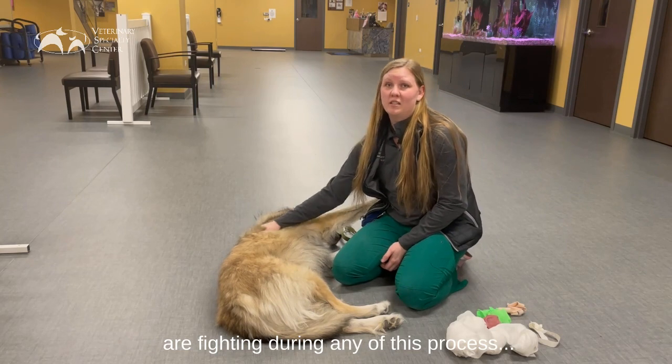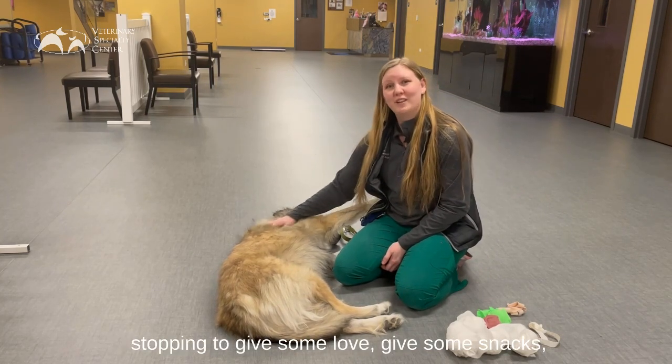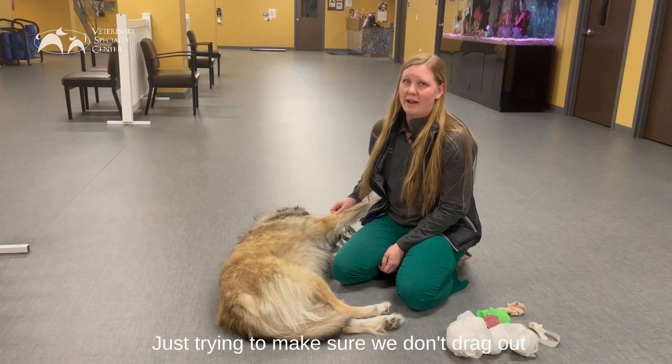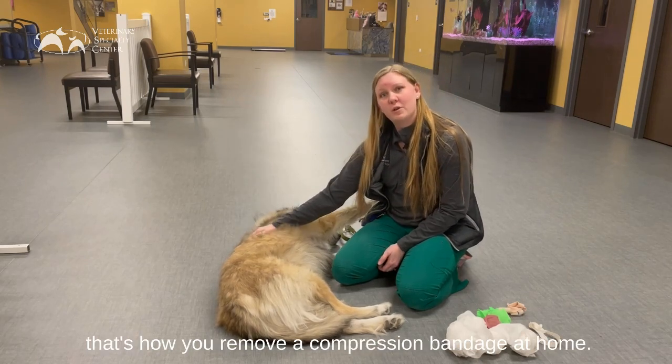If they are fighting or uncomfortable during any of this process, stop to give some love, give some snacks, give them some attention — giving them a little bit of a break is always encouraged. Just try to make sure we don't drag out the process so they don't get too stressed overall. That is how we remove a compression bandage at home.